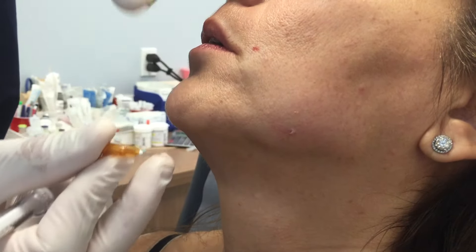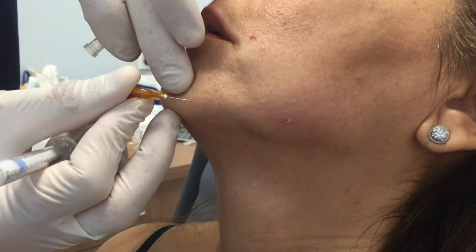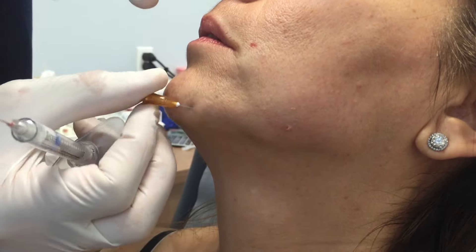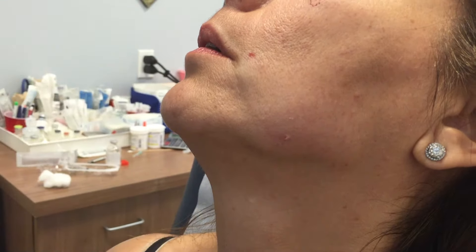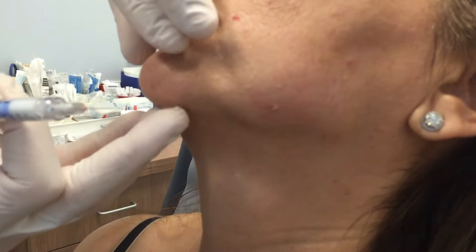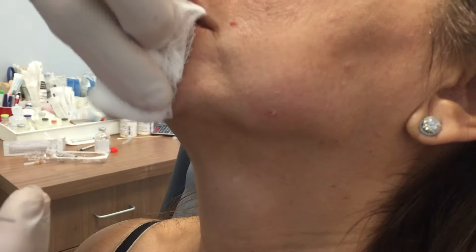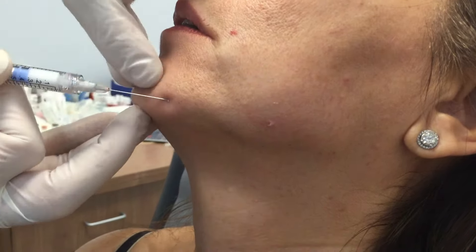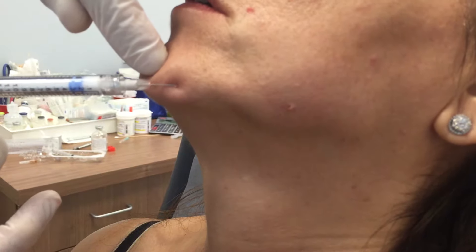This is part two of the video — we're just filling in the jowl. Just a little pinch here, you're going to feel sorry about that score a little bit. That's my little entry point there. I'm going very gently and smoothly, just filling a little bit right before the jowl, and then right along the jawline just to build it up a bit.